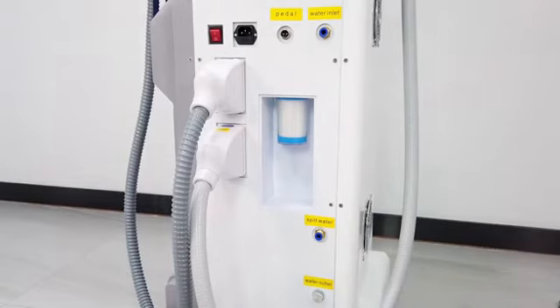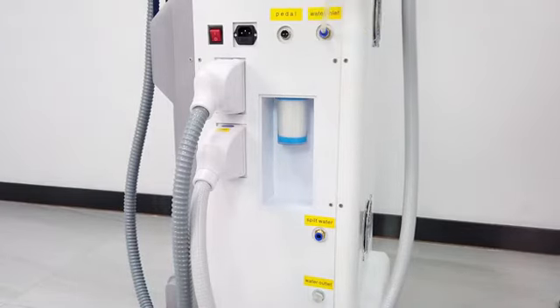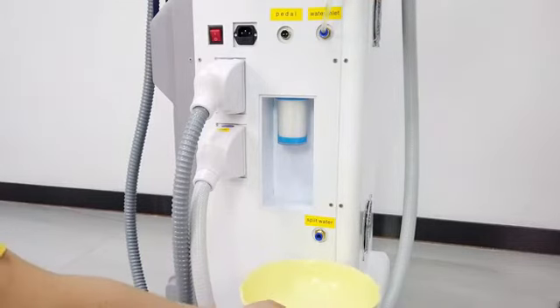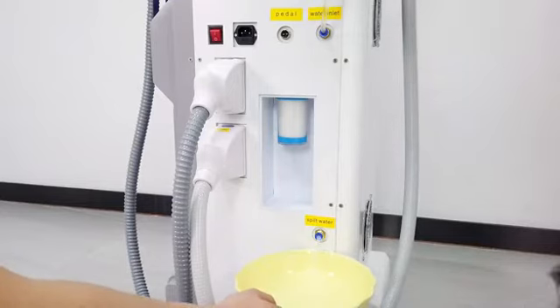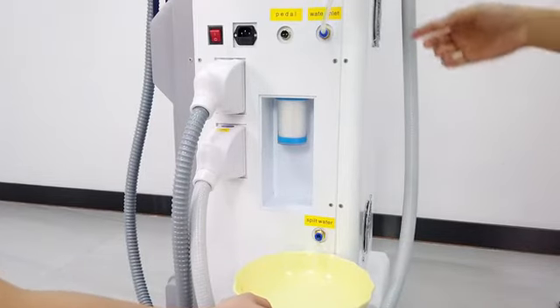Now we find a funnel and insert it in the water inlet and add the water. The water must be distilled or pure water. When we see the water come up from the spill water hole, it means the water is full and we can stop adding the water.